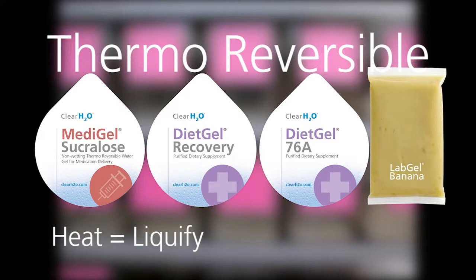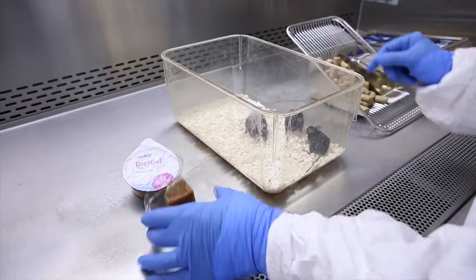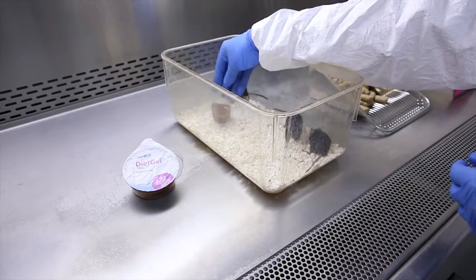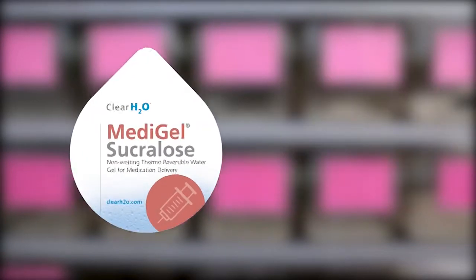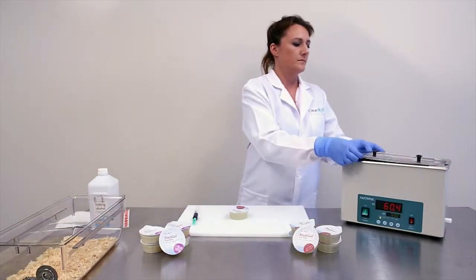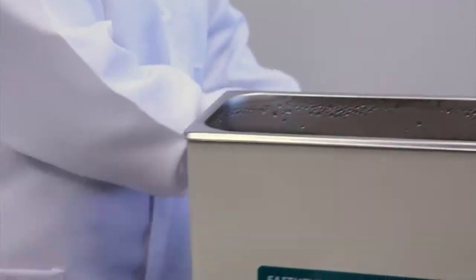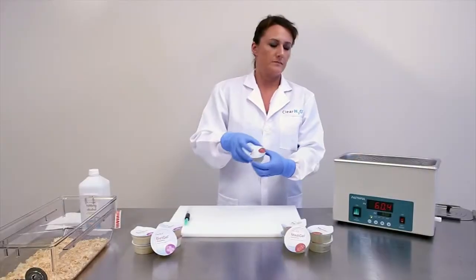Then, after medication is added, mixed, and allowed to cool, the gel re-solidifies and can be presented to your research animals for consumption. We will demonstrate the medication delivery mixing protocol that can be applied to all of ClearH2O's thermoreversible gels using MetaGel Sucralose as the example. To properly liquefy a thermoreversible gel, first place a cup of MetaGel Sucralose into a hot water bath at 60 degrees Celsius.